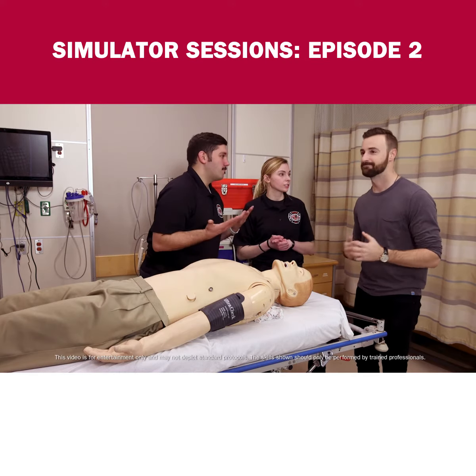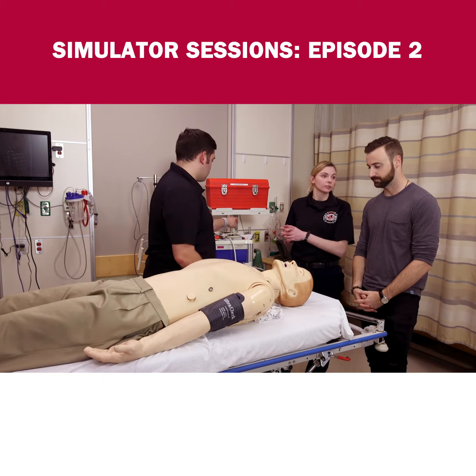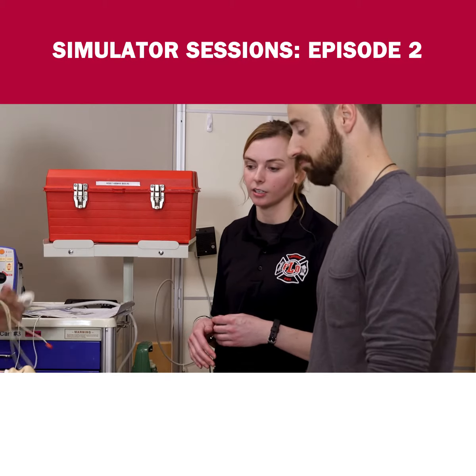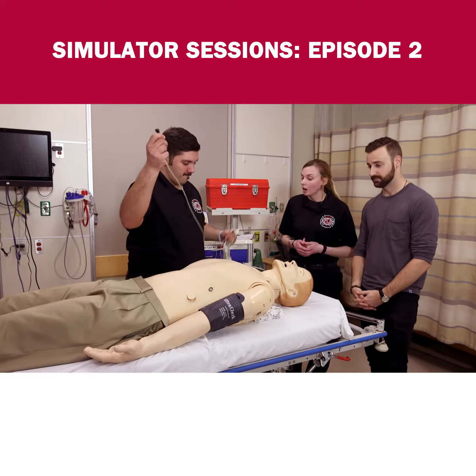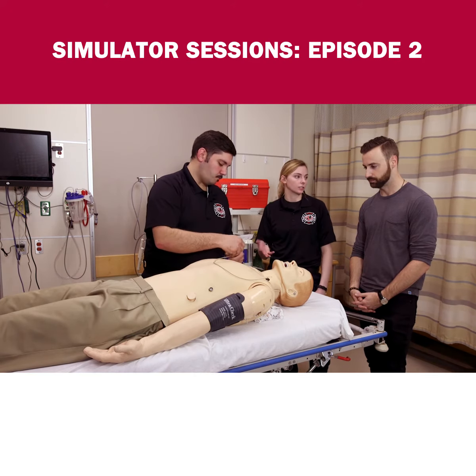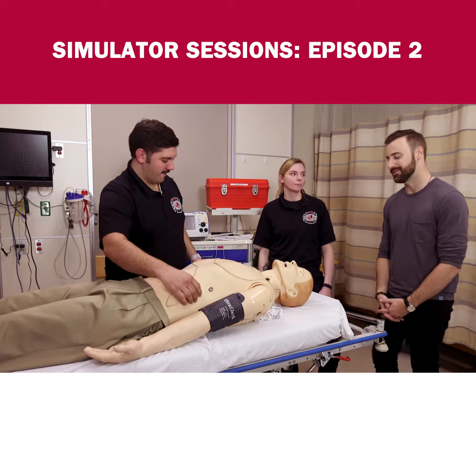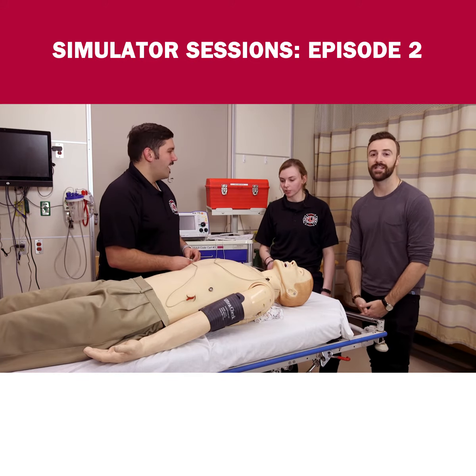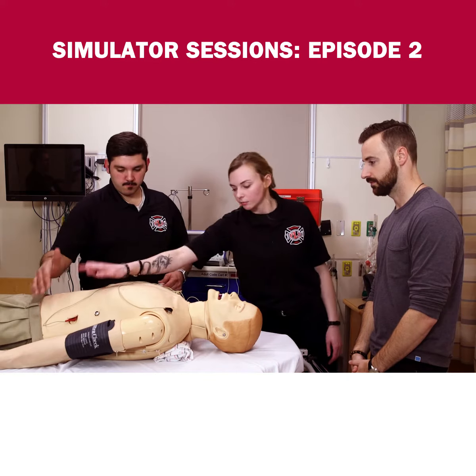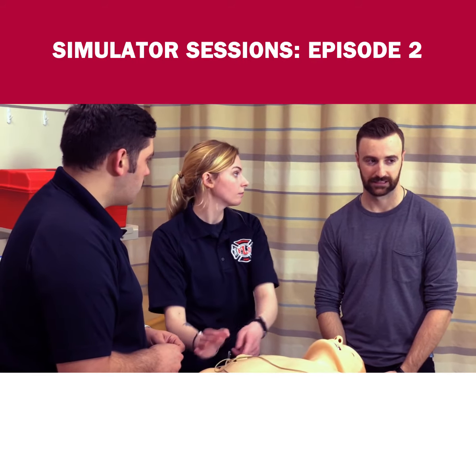We're gonna do a three-lead and we're gonna defibrillate. Adam here is gonna do all the work — that's just how this partnership works: he does everything, I stand here and look good. So a three-lead is basically going to show us a picture of the electrical activity inside the heart. You have two limb leads and one leg lead, and there are letters on the leads — as long as you can read: RA means right arm, right side.